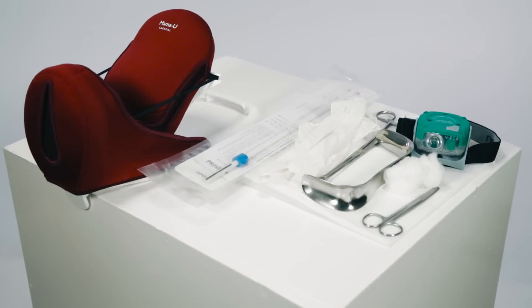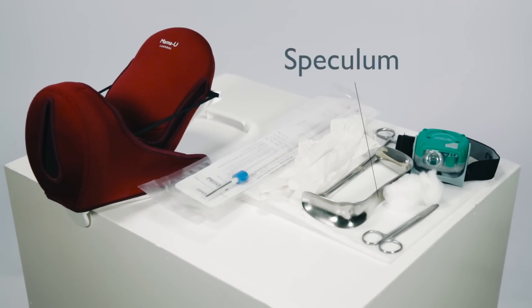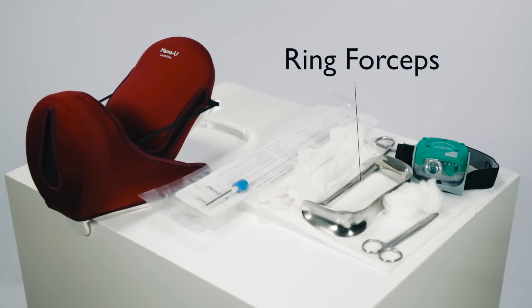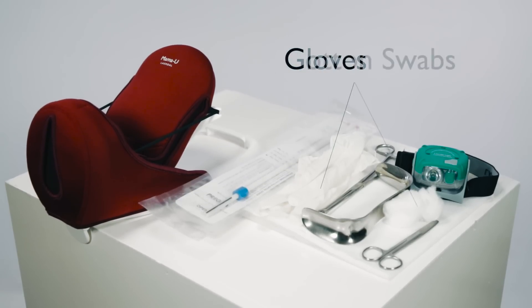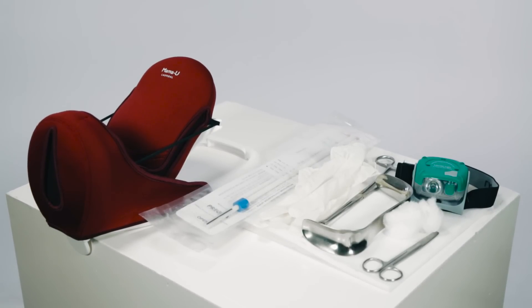To use the PP-IUD long inserter, you will need a speculum, ring forceps, gloves, cotton swabs, scissors, and a reliable light source such as the Lairdall light.